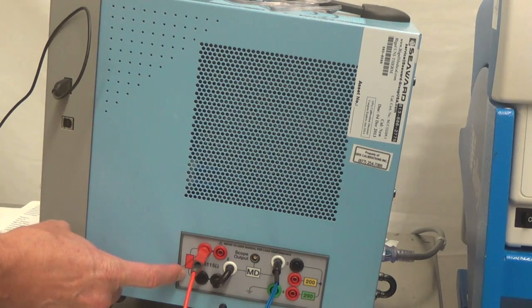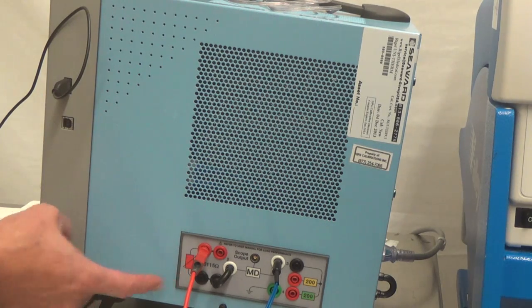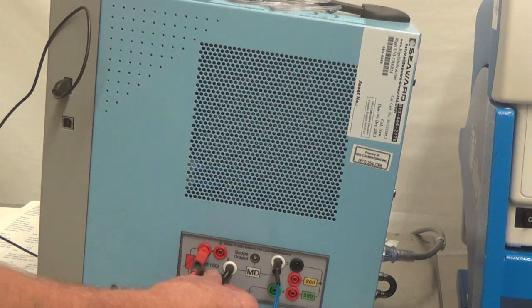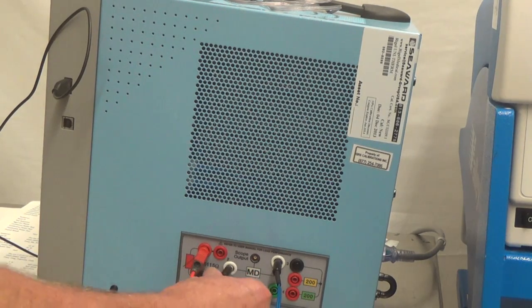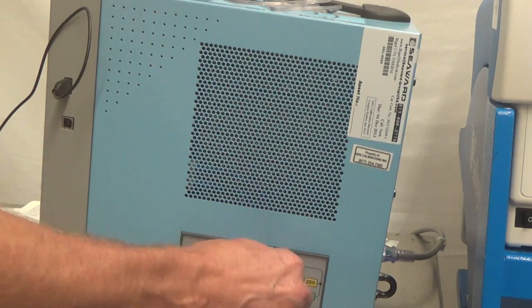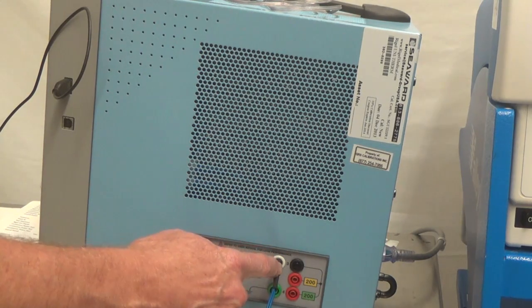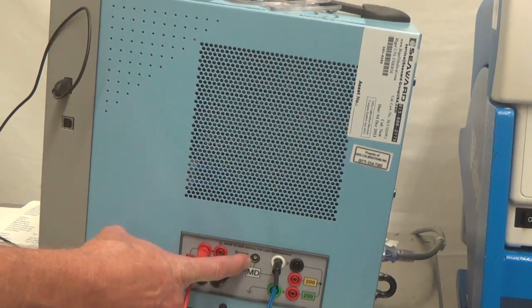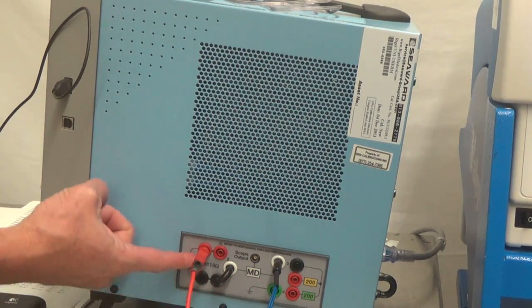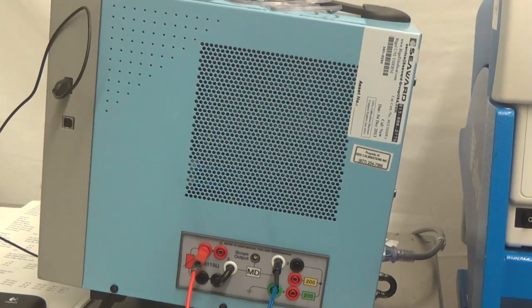The red rectangle with an arrow is a variable resistor that you program, and you can go anywhere from 5 ohms all the way up to 5,115 ohms. This jumper just builds the circuit. So you go across here, and this connector right here is going to your REM circuit. So this is your neutral or dispersive. If you want to look at it with your oscilloscope, you can also plug in there to monitor this loop here. So this is set up to do your basic RF output measurements.